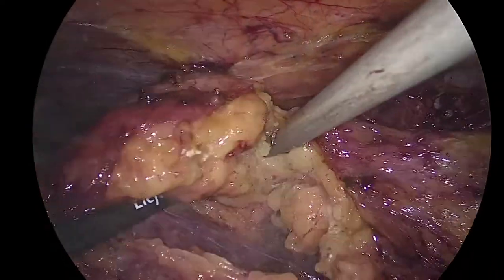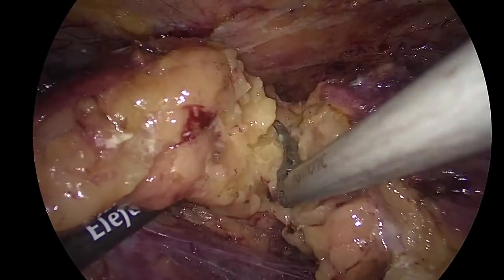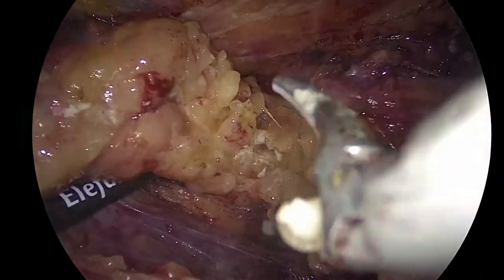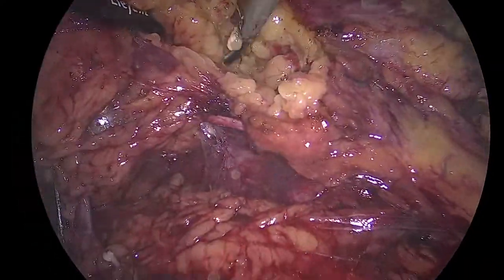now that I have the ureter out of the way, just be careful of your direction, eh? This is a 30-degree camera. That's why I keep saying be careful of your direction, because every time the camera moves, where's the ureter? Show me back. I want to see the ureter. Ureter is here. Nice. Okay.